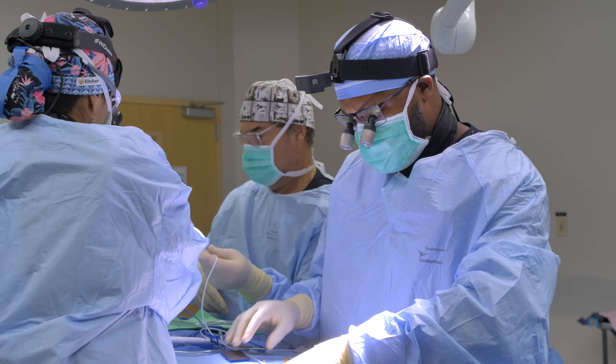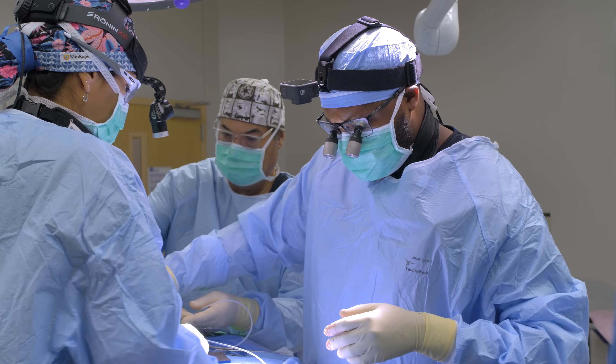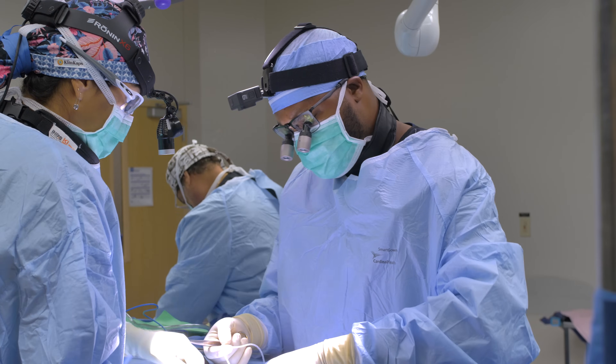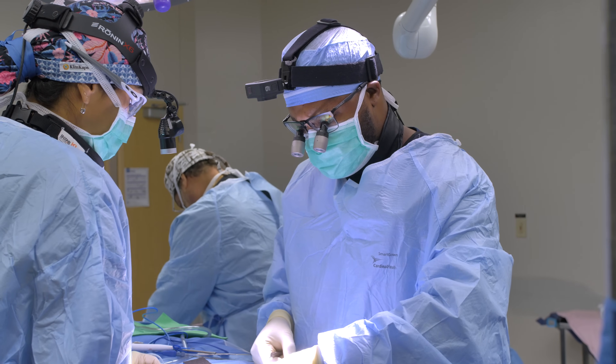We're placing a little drainage catheter in the patient's neck. If any fluid decides to accumulate, this will collect it and put it into a little reservoir so it's not staying inside his neck. We'll pull this before he leaves the hospital tomorrow.